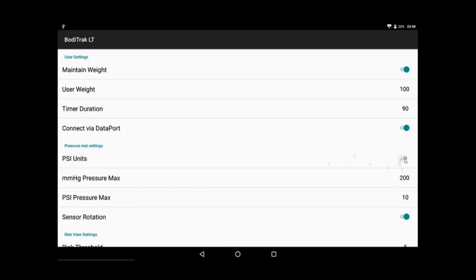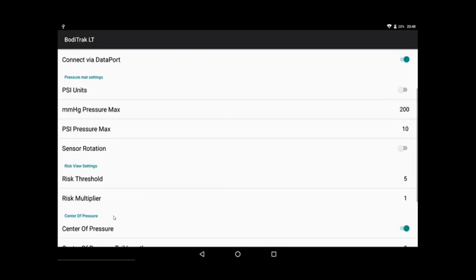You can use PSI units if you want. For instance, in bicycle seats, they would like PSI units typically, and they want to go up to 40 PSI. Also, we have a sensor rotation here. We talked about that before.